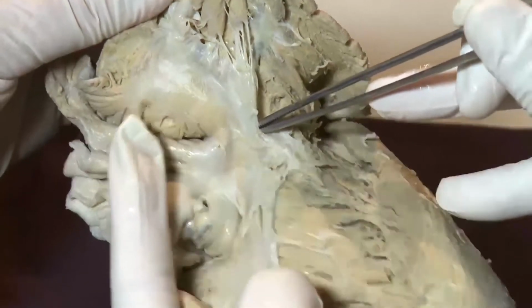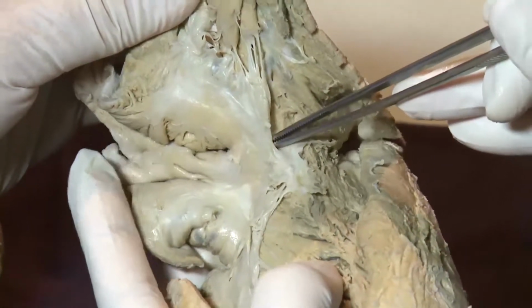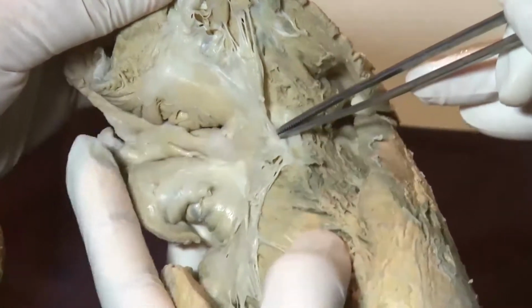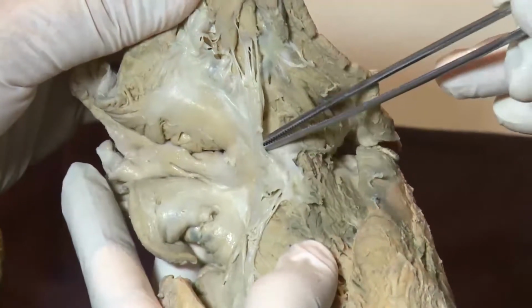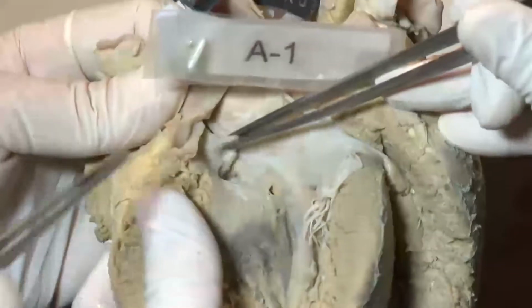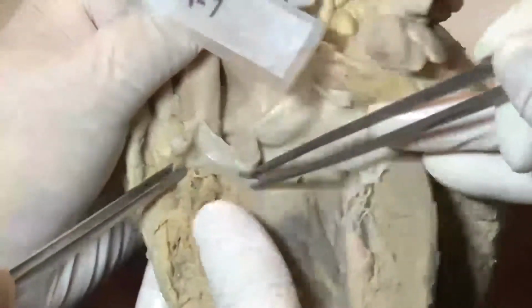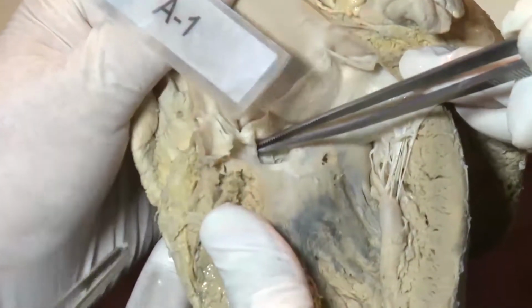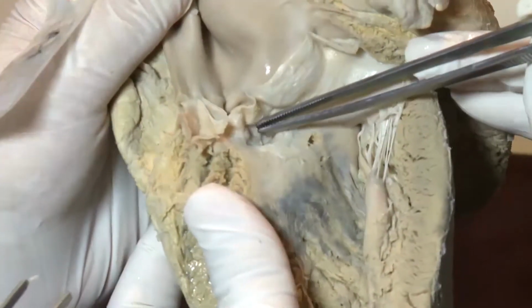So when we use a device to close the VSD, we should consider not only the conduction system, but also the danger of damaging the tricuspid valve leaflet, and even the aortic valve leaflet from the other side, as there is a very close proximity of the aortic valve like this. So it is really important to consider the damage to the adjacent structure when we close the VSD by device.